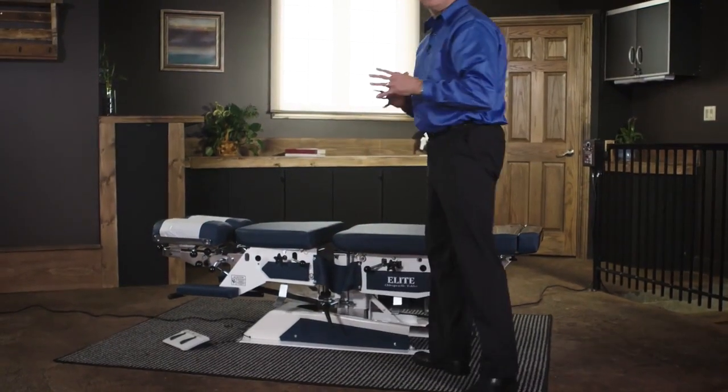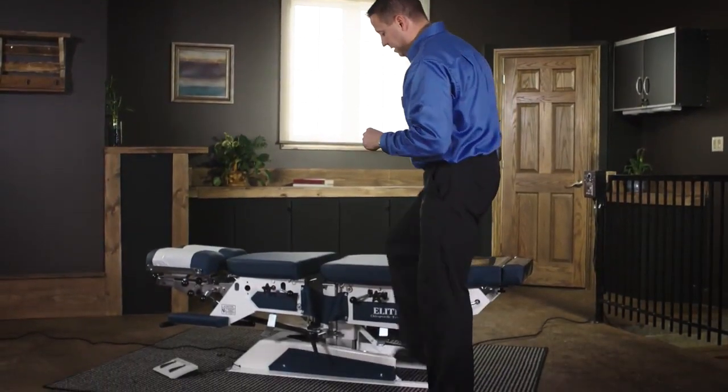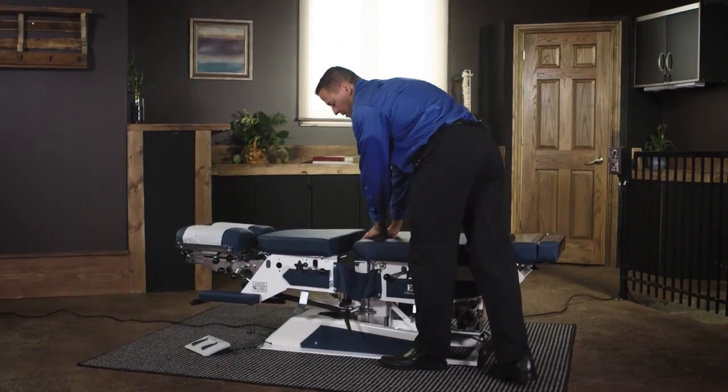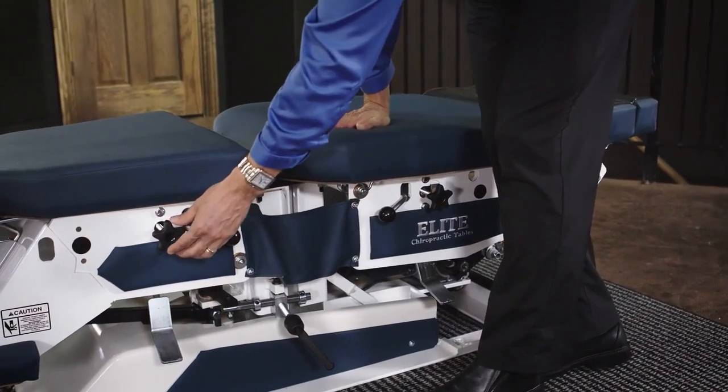This table has two drops in the main part of the table, and those are both foot cocking mechanisms. The drop is set by simply pushing onto the foot cocking mechanism. If you want to adjust the tension of that drop, this is done by these two knobs here.